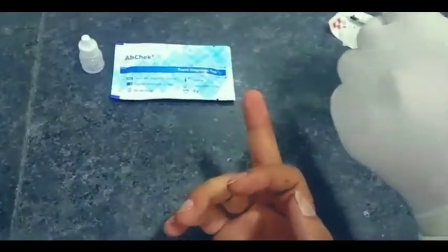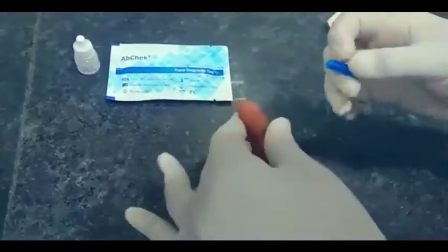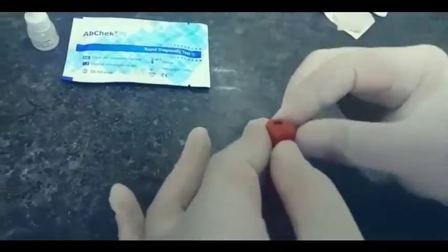Let it dry. With the help of the lancet, prick the finger. Take 1 drop of blood and dispense it on the sample well.